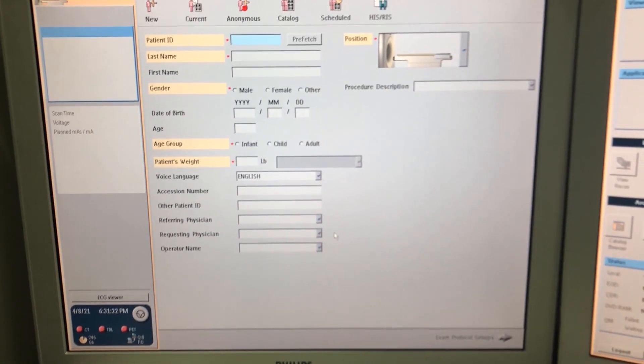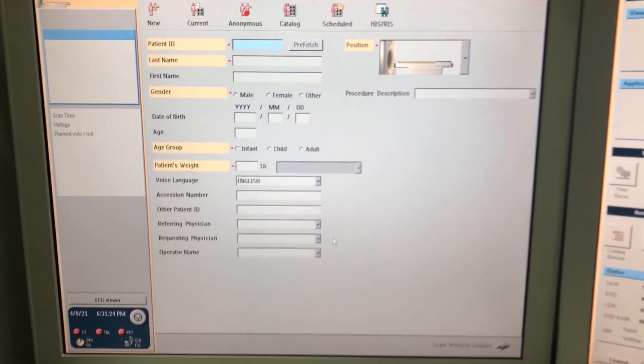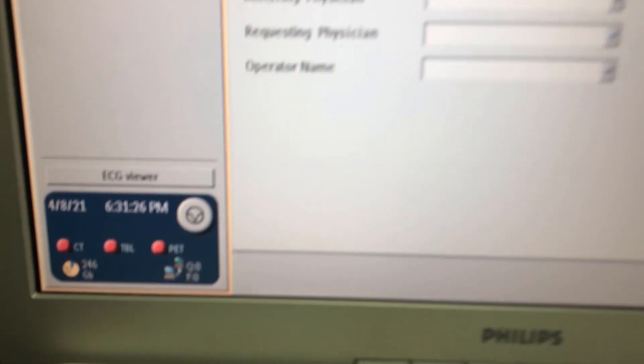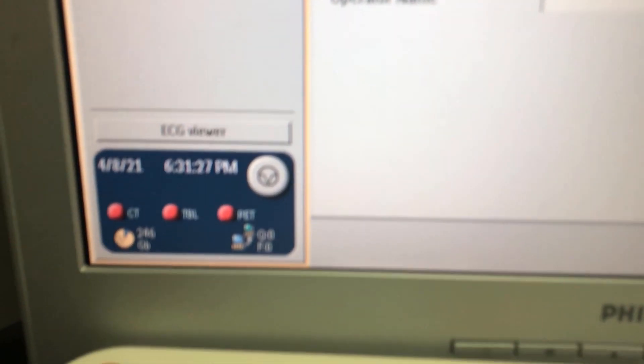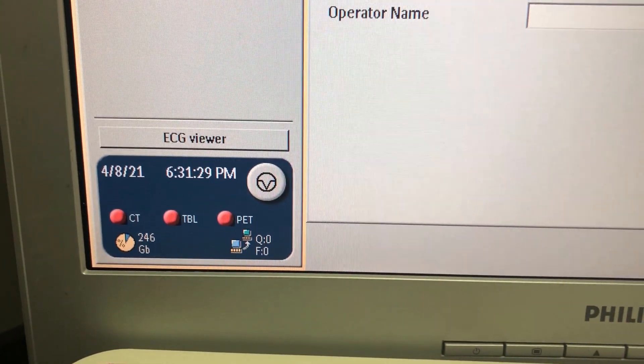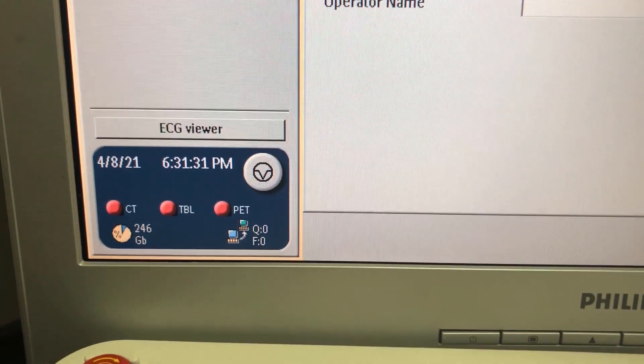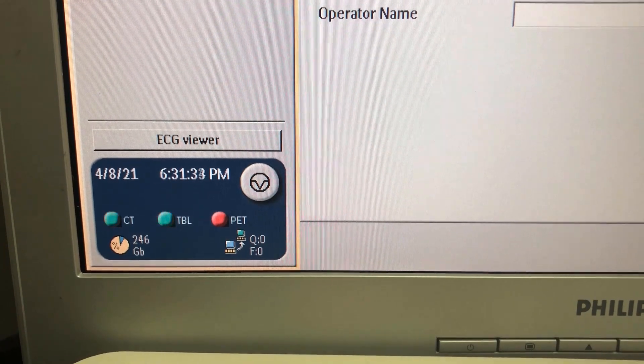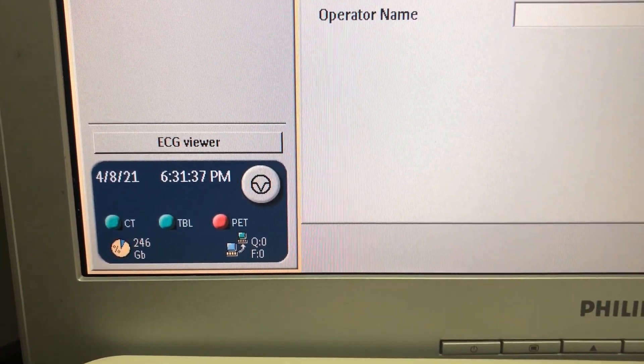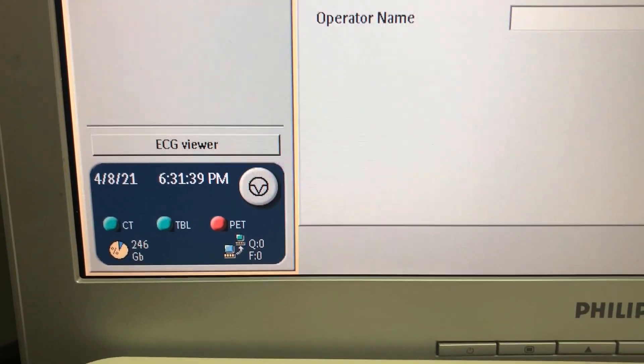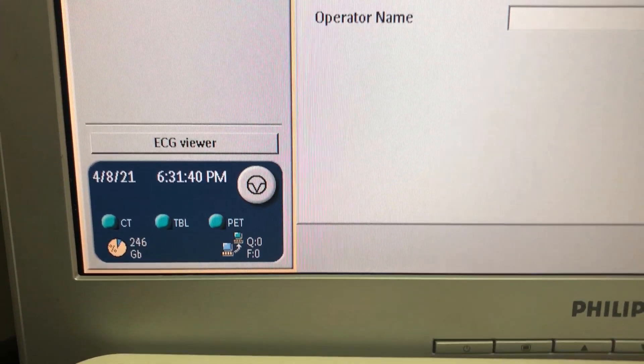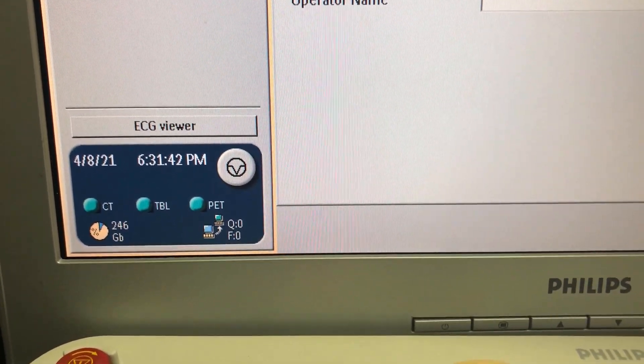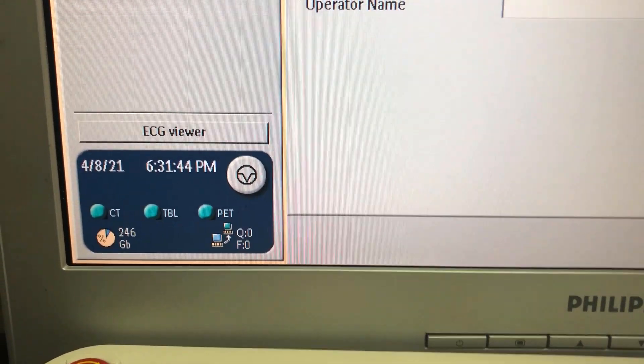Now if you look in the bottom left of the screen, you should start seeing the CT and table readiness monitors turn green. Now the pet normally stays red for just a couple minutes after we start up. There we go.